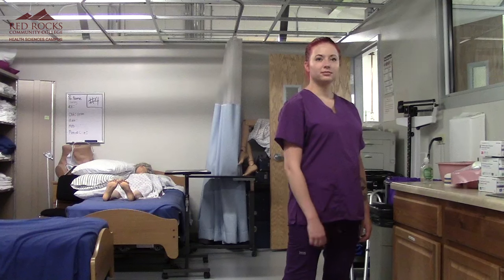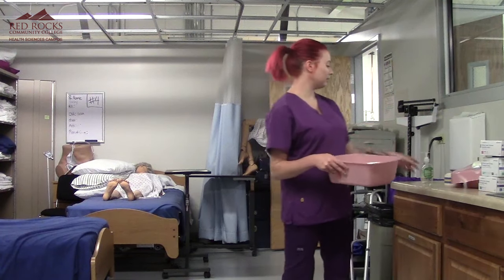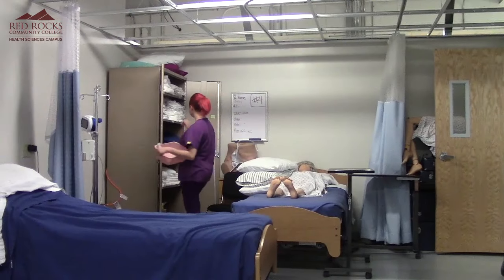Provides catheter care for a female. I've got my basin and my soap, and I'm going to go over to the linen closet and grab two towels and three washcloths.